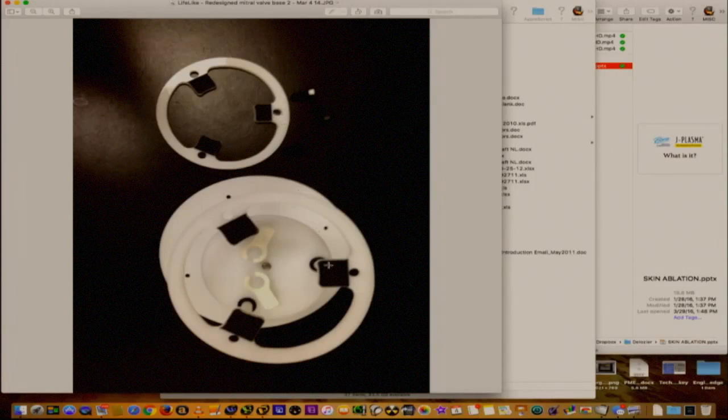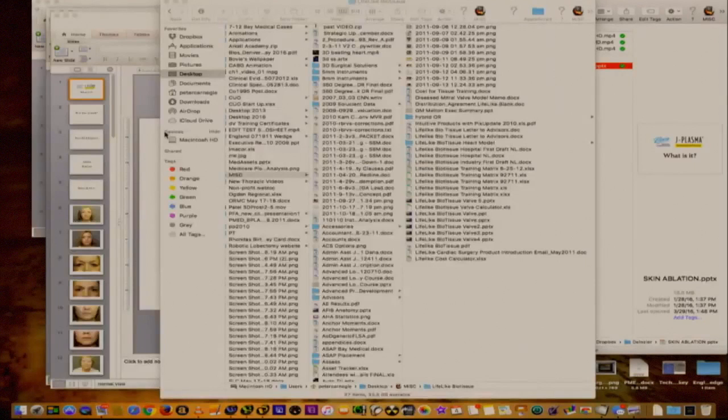And so this plate would go on top. We would screw that in, and it would actually hold it in place, even with very strong movements of a needle driver to drive those needles through the tissue. Pulling and tugging that typically happen inside the heart, we were able to replicate those and secure that model in a way that the doctors were able to practice and feel the same kind of tensions that they would feel whether they were using their hands or if they were seeing that tension created by the robotic system. And that was part of making sure that we developed something that was very, very accurate.